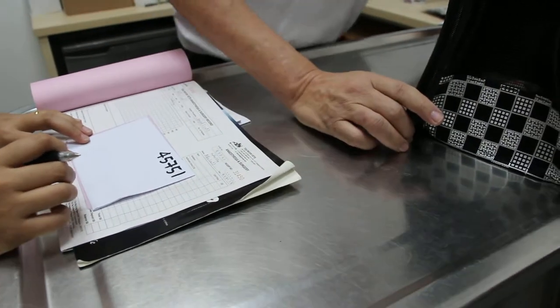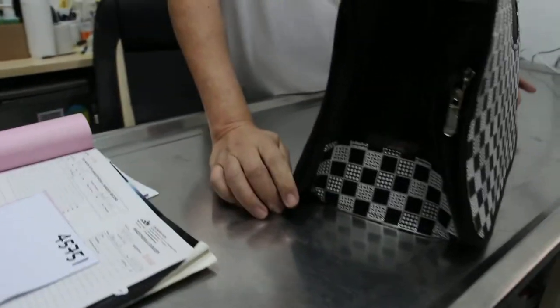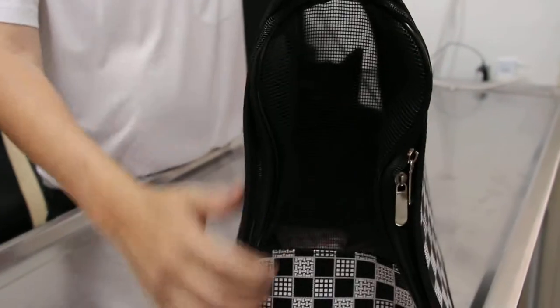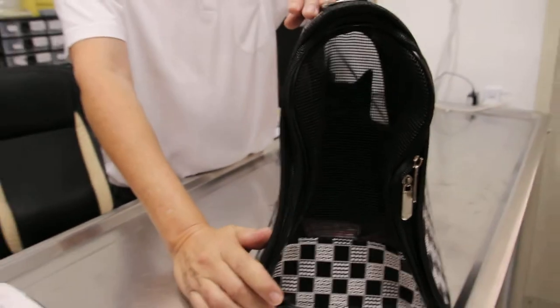Because the anesthetic dose in this case is not very dependent on the weight, since we are using isoflurane gas. When we use isoflurane gas, we put the gas into the carrier and then the cat will sleep. Once the cat is sleeping, we take the cat out and neuter him, and of course we put the mask on again so that the anesthetic continues.